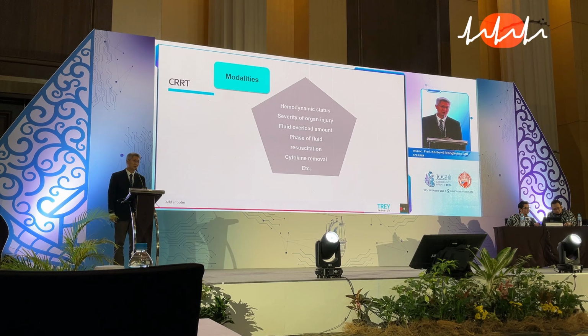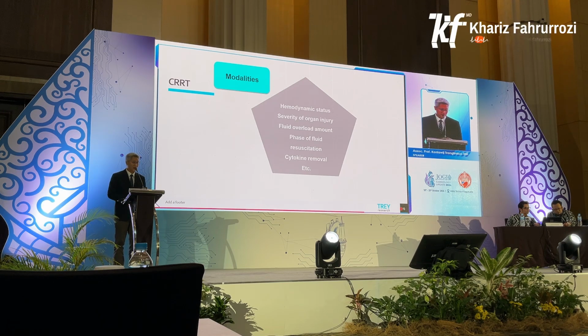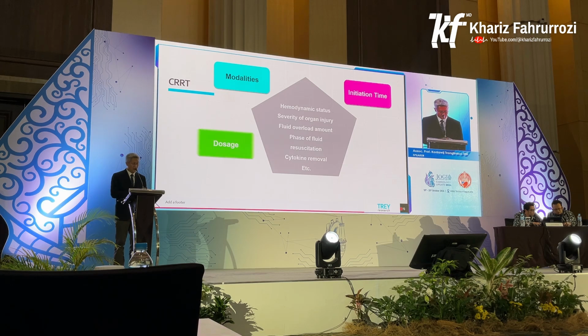CRRT prescription is similar to medication. We need to focus on which drug or which modality is appropriate for the patient. The second thing, what is an appropriate time for initiating CRRT, and how much dosage do we need to perform in this patient, and how to monitor, and the last one, when is the appropriate time for discontinuation.